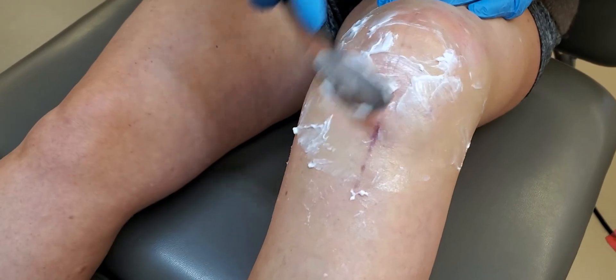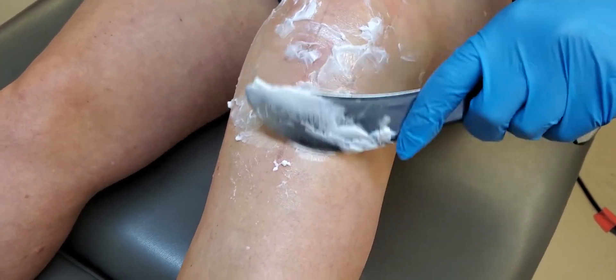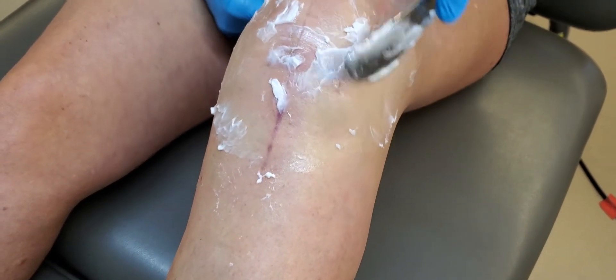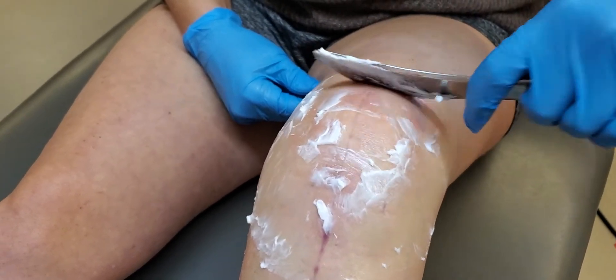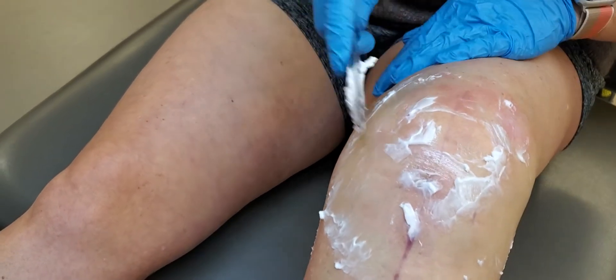Notice how we're keeping about a 45-degree angle to the skin with the tool versus 90 degrees. The significance of this is it disperses the amount of pressure applied with the tool against the skin so that we're not causing any bruising or adverse reactions.